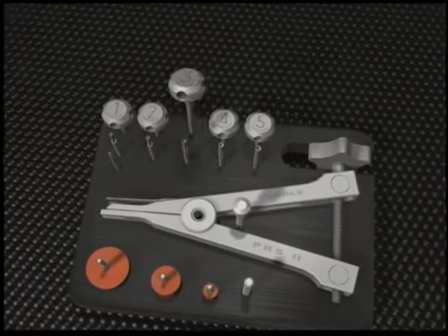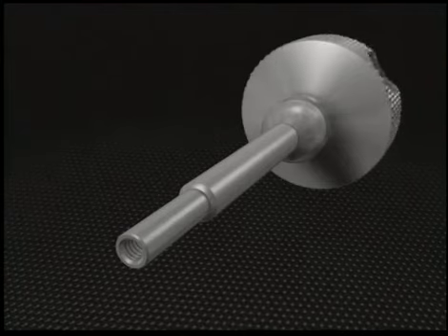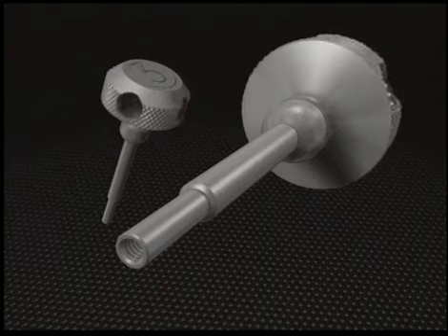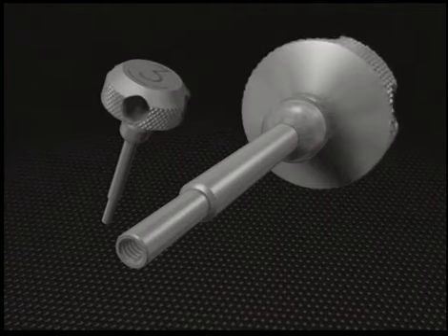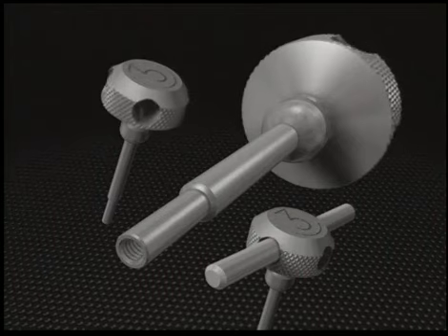The working end of the tap contains a tube that internally has left-handed threads and is approximately 4 millimeters in depth. The proximal end of the tap contains a well-engineered handle that is oversized to enhance motor control, beveled to provide comfort, and knurled to encourage a sure grip. Additionally, a torque bar can be inserted through the handle port for added comfort and leverage when removing a large post or an actively engaged screw-type post.